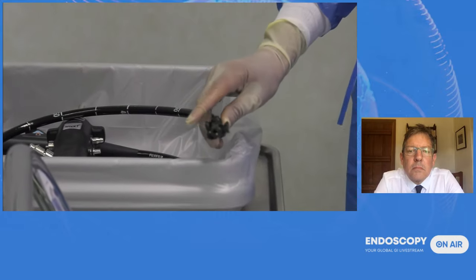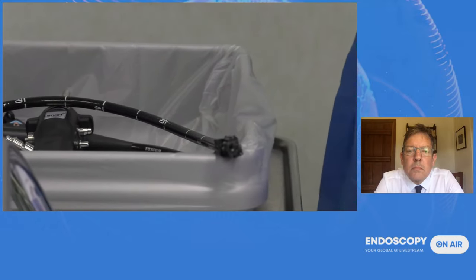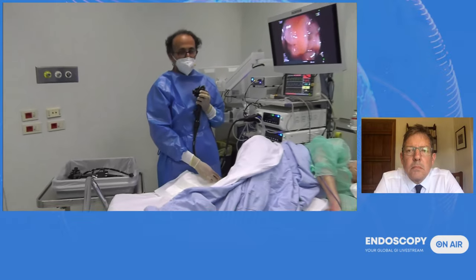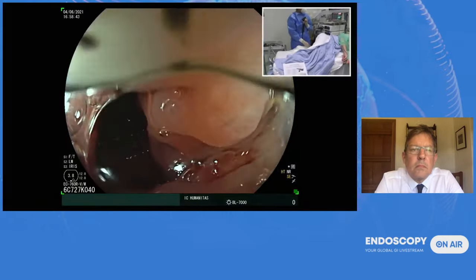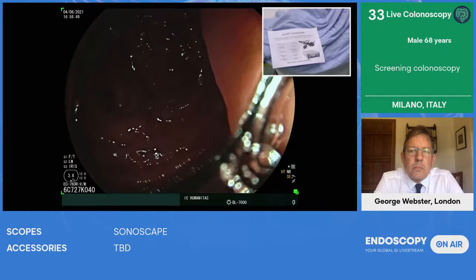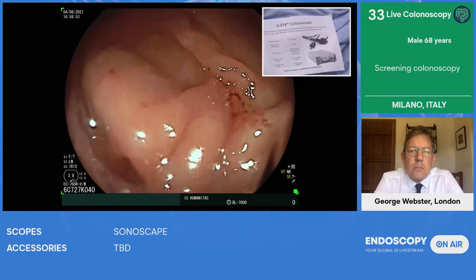This balloon can be handled very simply with a controller, and you have either a handable controller or a pump. You can insufflate in three positions, and usually we use the intermediate, and now I just push the pedal, and the light is lamping, and this means that the balloon is inflating.